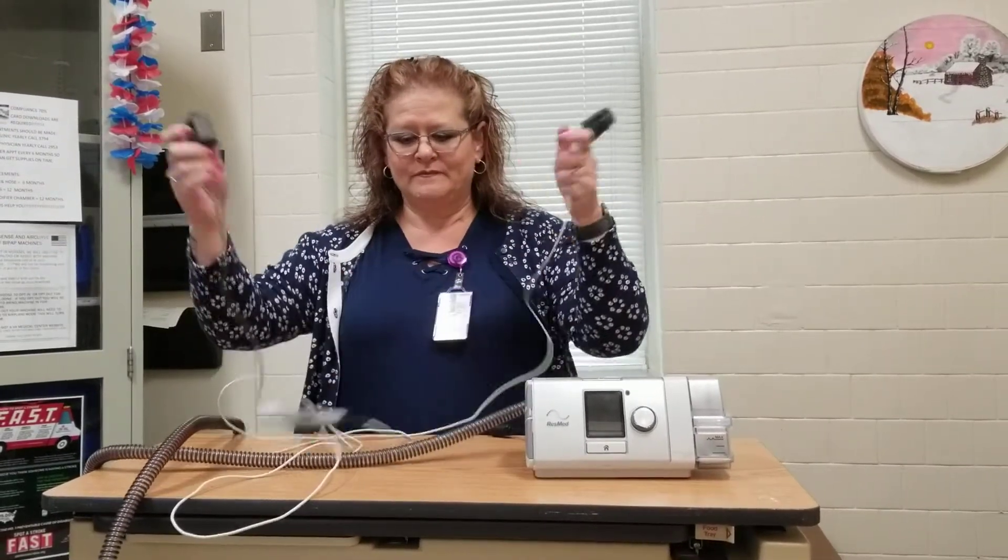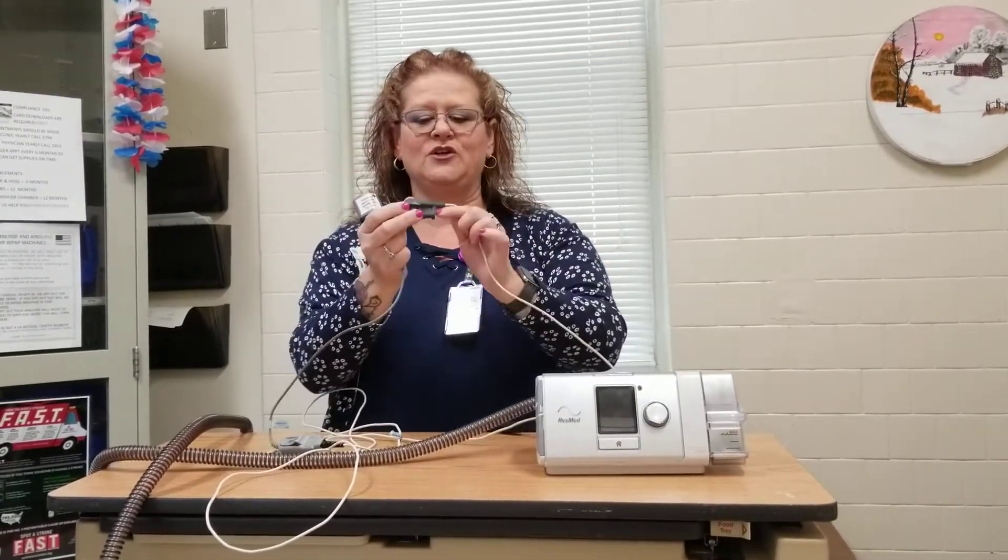So this is what it looks like. This part hooks into your machine, and this part you simply wear on your finger for two nights. That's all there is to it.